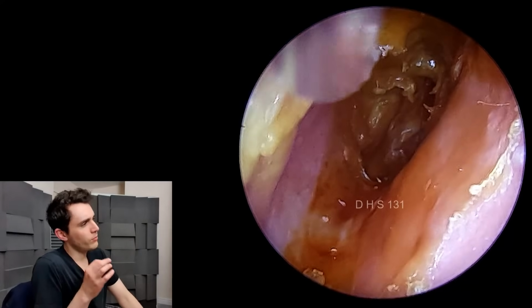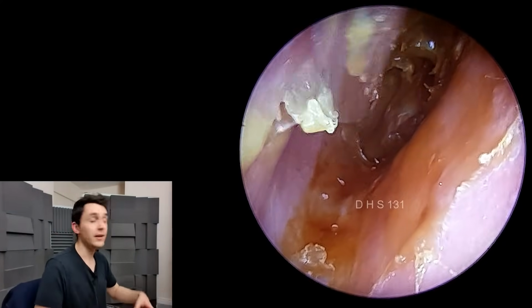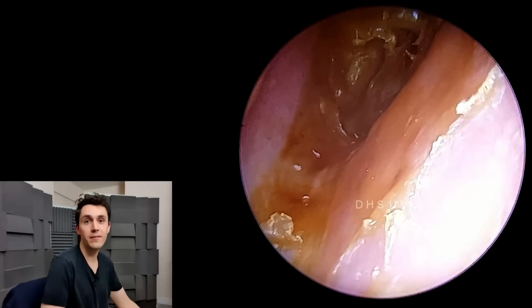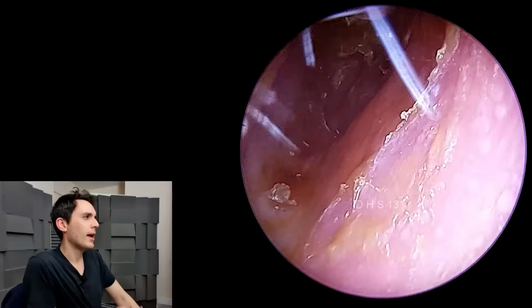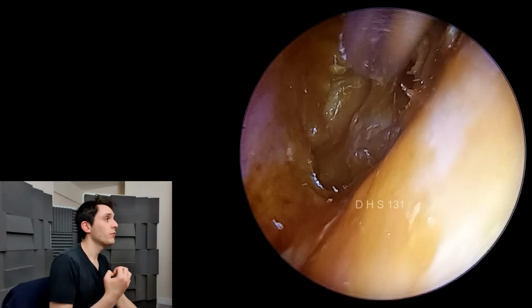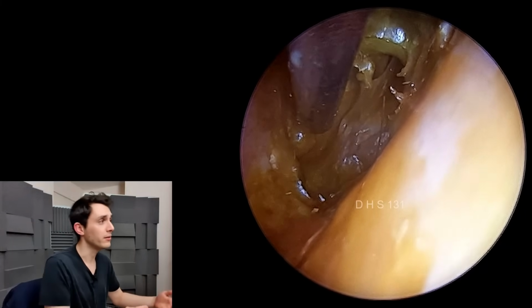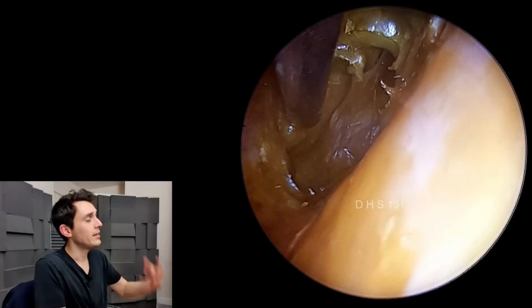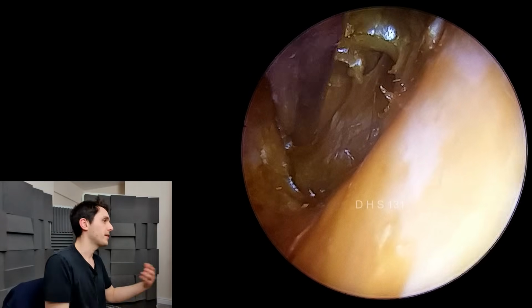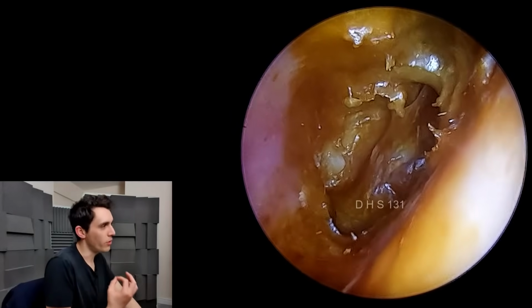So some of you are probably wondering, why do both his ears get infected over and over again? There must be a reason why his body isn't fighting off the infection. Why is this happening? And we're not entirely sure. This patient has gone through the classic cycle of ear cleaning and debridement of skin, medication, debridement of skin, medication, debridement of skin, medication, and so on, which should work, but it's not.